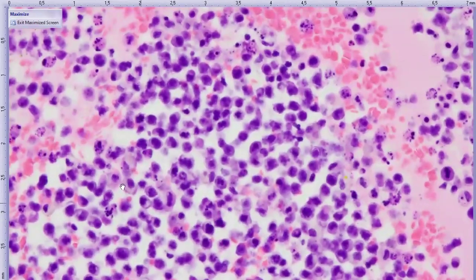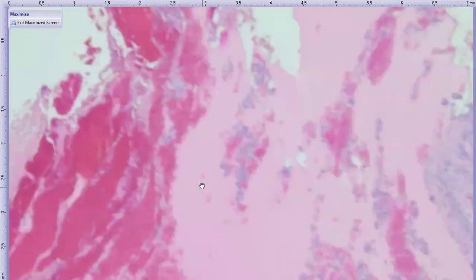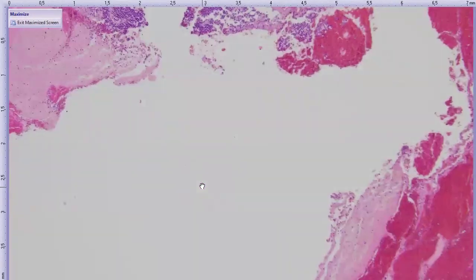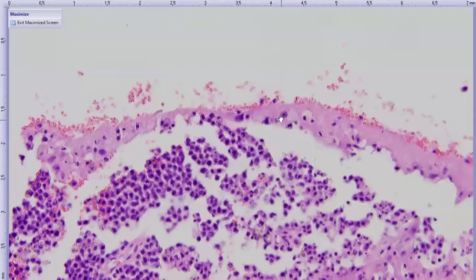A lot of these are also probably macrophages, like this guy here is probably a macrophage, but some of these guys with the larger nucleus and less cytoplasm could be a similar population to what we're looking at. There's also some pycnosis occurring here as well, so some of these cells are degenerating. And there are significant areas of the retina that I thought were necrotic. And let's see here, like this area right here, here's retina that kind of becomes difficult to identify the retinal layers, and then we have a similar population of cells that's sort of in the retina.